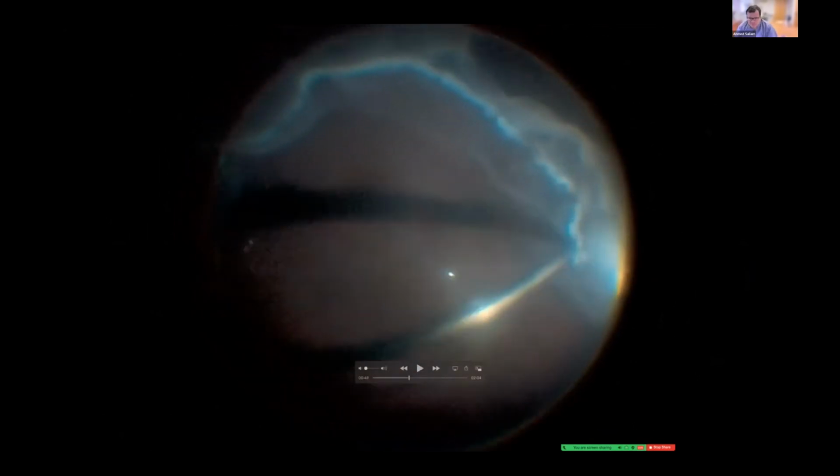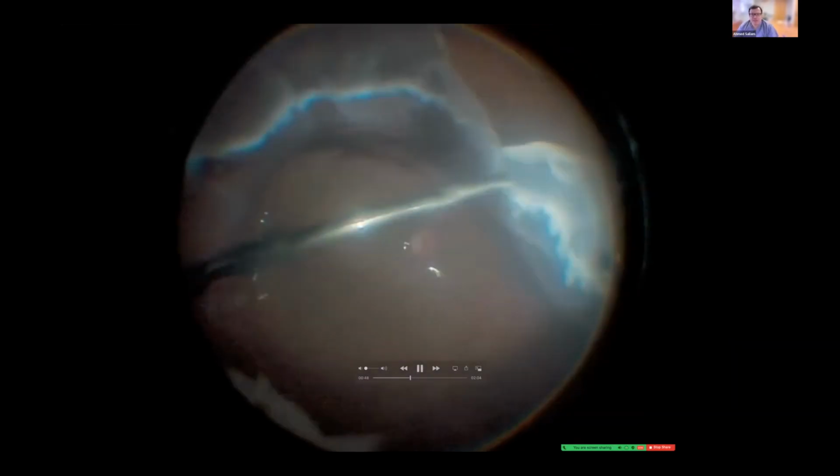So, buckle versus retinectomy. For PVR, I start by peeling posterior to anterior if there's anything to peel. I usually don't peel the ILM unless it's part of the epiretinal membrane, and then I would peel it. Then if the shortening is small, I would put a buckle, and that's usually an encirclement. If the shortening is more than small and there's extensive shortening and stiff retina, especially near the breaks, then we go for a retinectomy. And once we decide on a retinectomy, there's nothing called a small retinectomy, in my view, and I always go into a big retinectomy, extending into a healthy retina, like this.